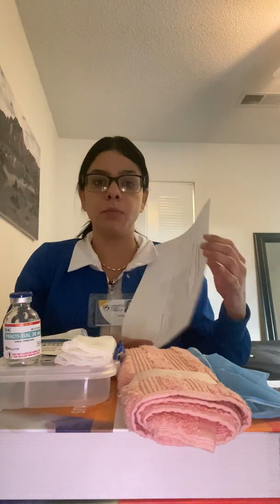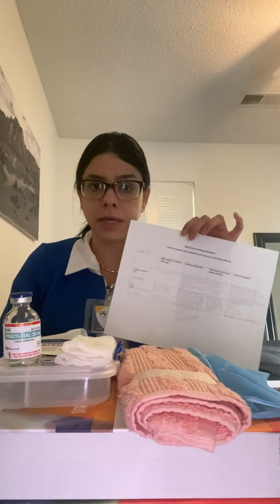Before I start doing anything, I'm going to make sure that my patient is comfortable, that the environment is safe, that the bed is locked and in the lowest position, and that only two rails are up. If she has any questions before we start, I want to address that first. I want to explain to my patient what I am going to do one more time. Basically, I'm going to give her a flu vaccine per physician's order.